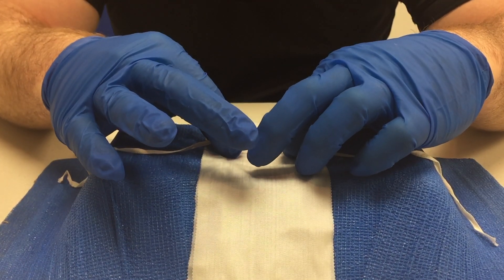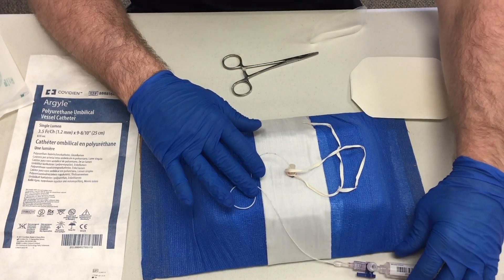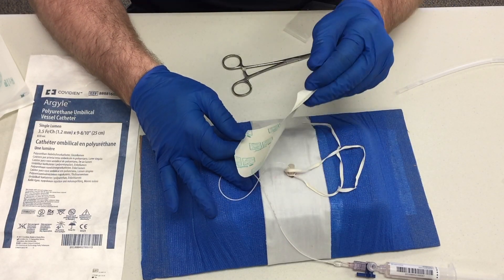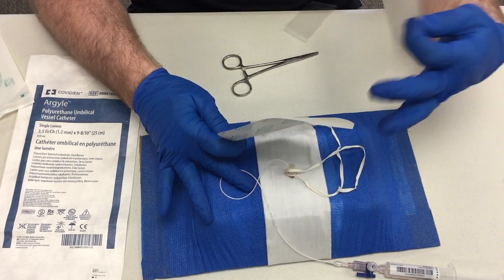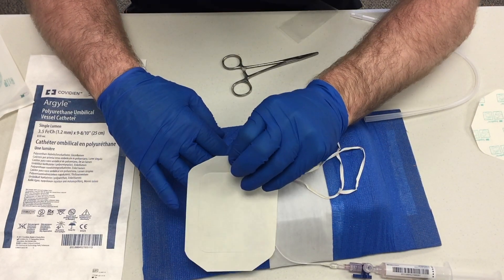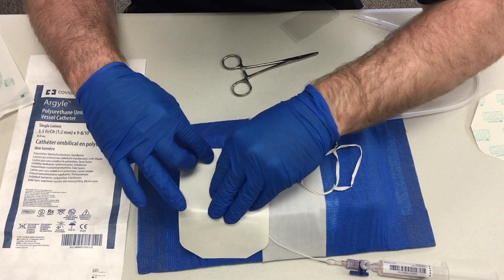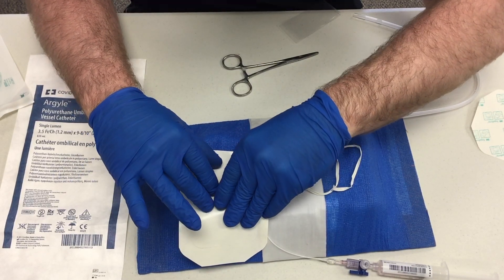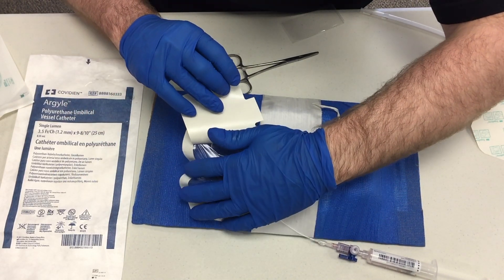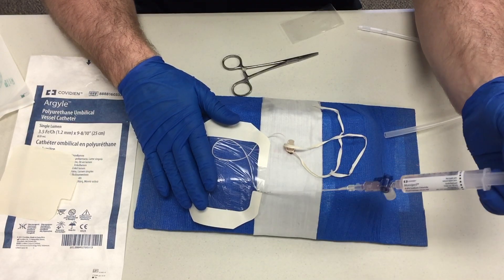At this point it would be appropriate to reassess the knot around your umbilical cord to secure the catheter in place. Finally, to secure the catheter itself, loop it and then use your Tegaderm and place it over the loop but not over the umbilical cord. Based upon the size of the infant you can cut the Tegaderm in half or into smaller pieces. Placing the Tegaderm over the loop in this fashion reduces the risk of any bumps or snares pulling the catheter out of the umbilicus.